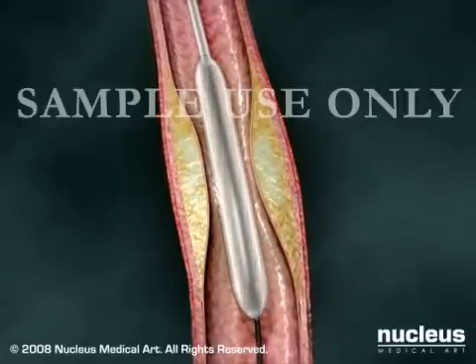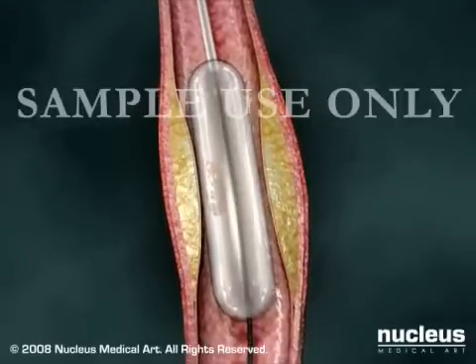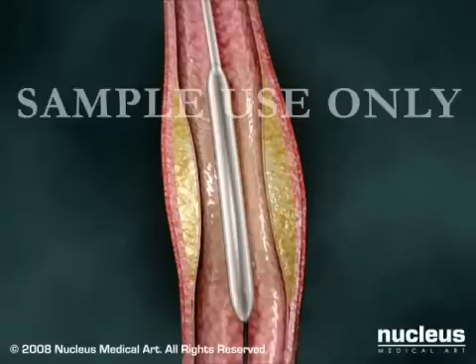You may feel some chest pain while this is happening. The same procedure is repeated for each blockage being treated. Afterwards, your doctor will withdraw the deflated balloon and catheter from your arteries.